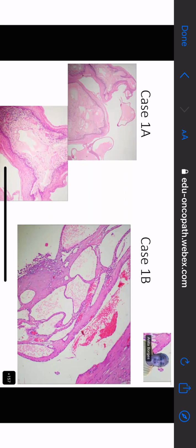Now, if it is not epithelial, I think it would be hard to call it a secretion. If we do call something a secretion and it is not epithelial, what do we say? We call those things matrices, no?